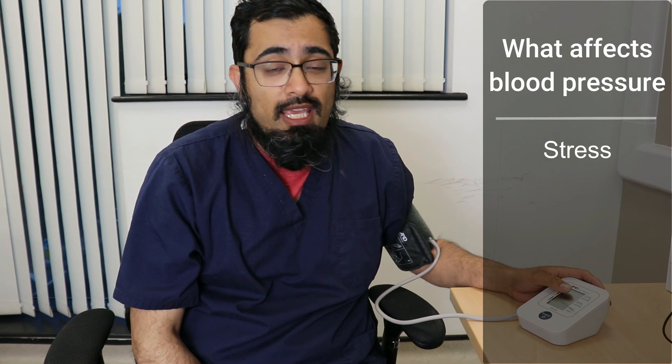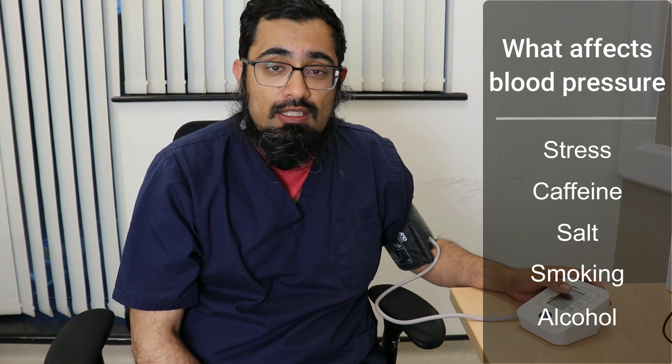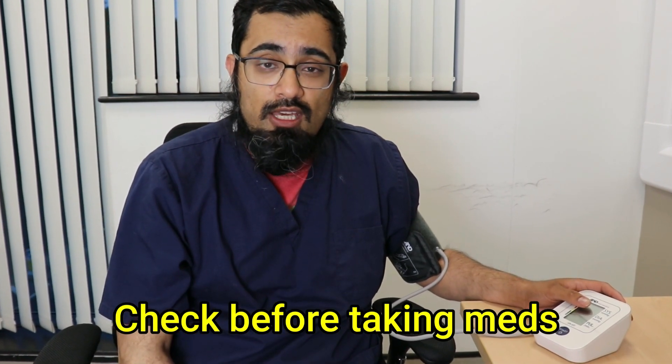Certain things will push your blood pressure up — things like stress, caffeine, salt, smoking, alcohol, and various other factors can also have an impact. If you are taking medication for your blood pressure, it's generally better to check your blood pressure just before you've taken those medications in the morning.